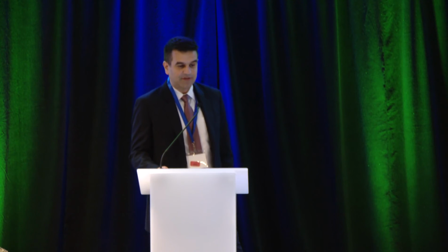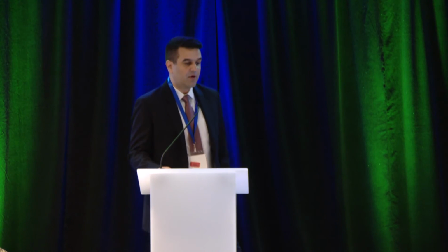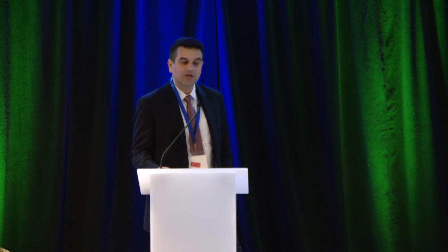Now, moving on, if you do not meet criteria for achalasia, but you do have an abnormal median IRP, how do you end up getting down to EGJ outflow obstruction, a much harder diagnosis to make than it was for Chicago 3.0? One of the main highlights of 4.0 in this disorder is that a manometric diagnosis of EGJ outflow obstruction is always clinically inconclusive. And to actually make this a clinically relevant, conclusive diagnosis, you need several things.